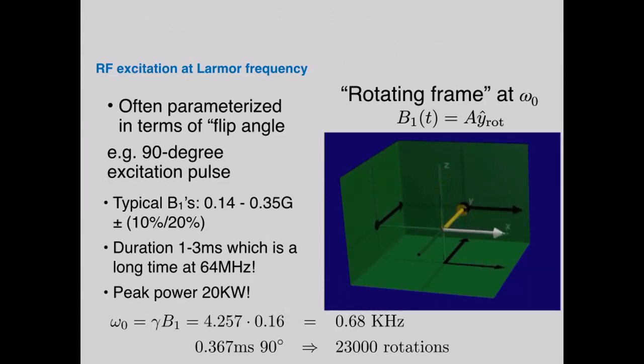In the rotating frame, right? In the lab frame, it's actually behaving quite a bit differently, it does the spiral thing. It's a complex motion. But in the rotating frame, this motion is very simple.